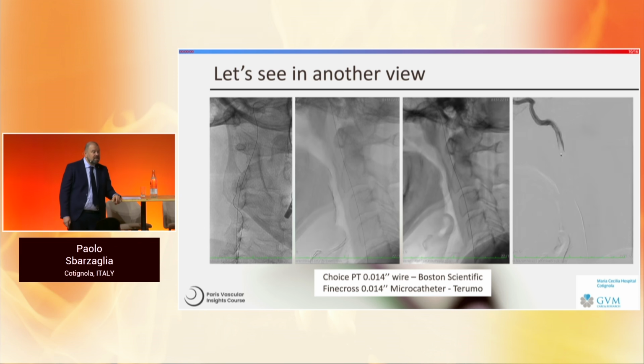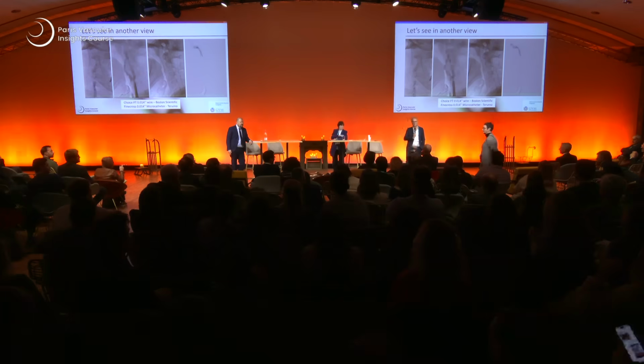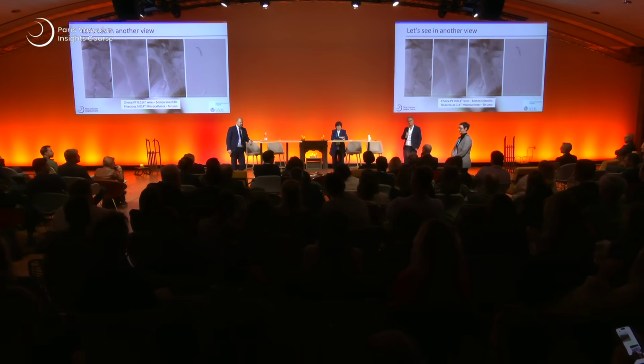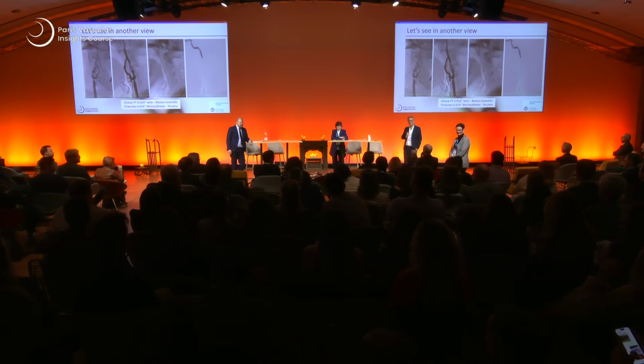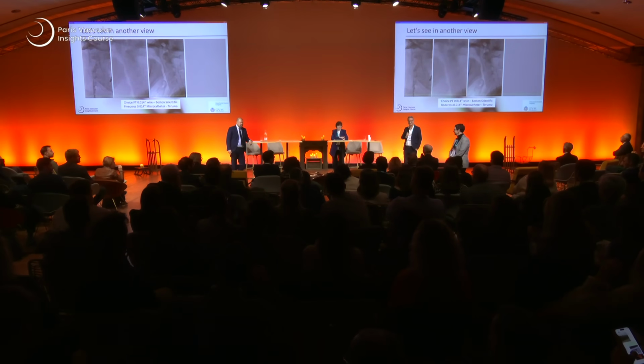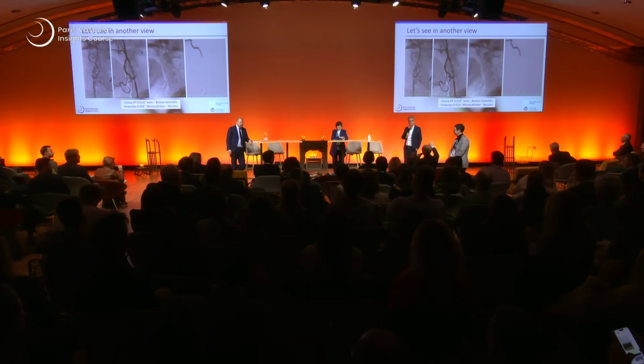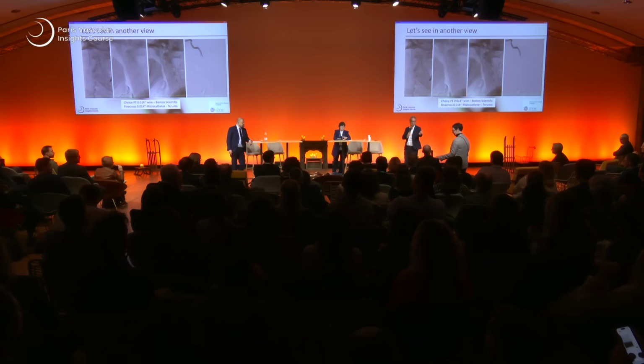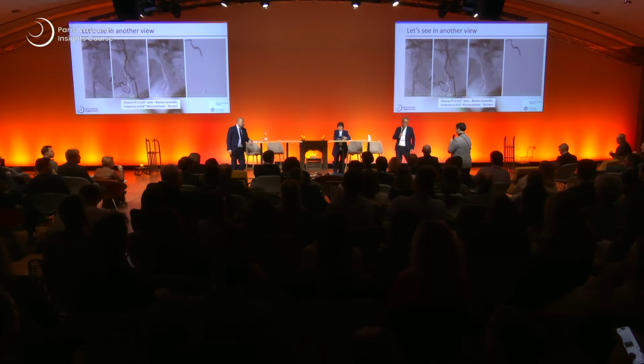Just a quick question, because maybe I missed it. Are you using any kind of neuroprotection for that wiring? No. As a friendly reminder, you can do TCAR in restenosis after CEA, and you could be protected before you start with the wiring of that kind of complex lesions, at least to use the flow reversal.